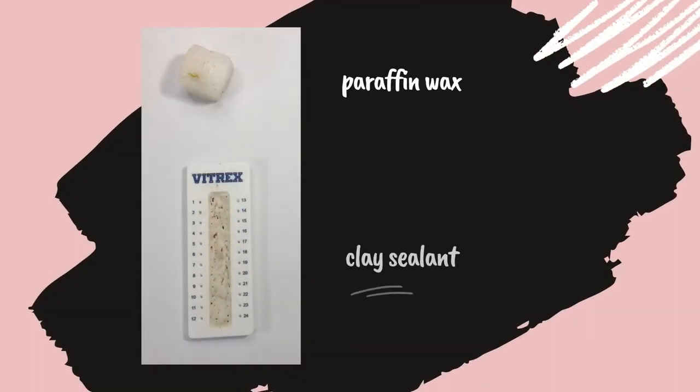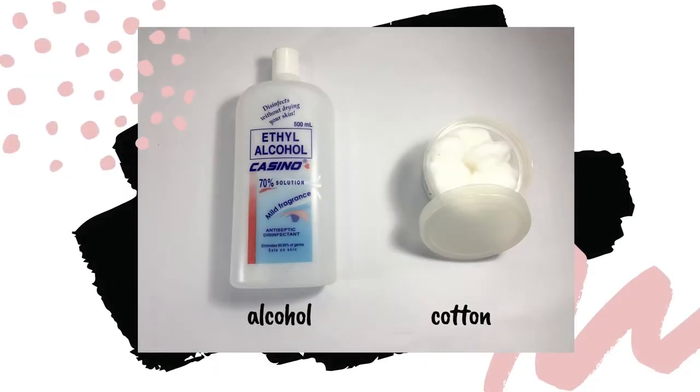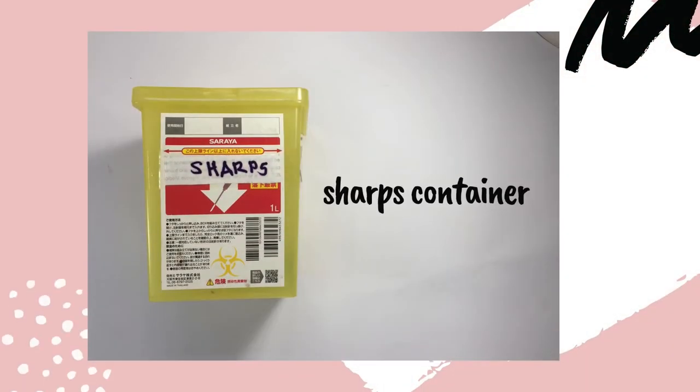Next, paraffin wax and clay sealant to prevent the sample from spilling. We also need alcohol and cotton for disinfecting the puncture site, and lastly, a sharps container for disposal of used lancets.